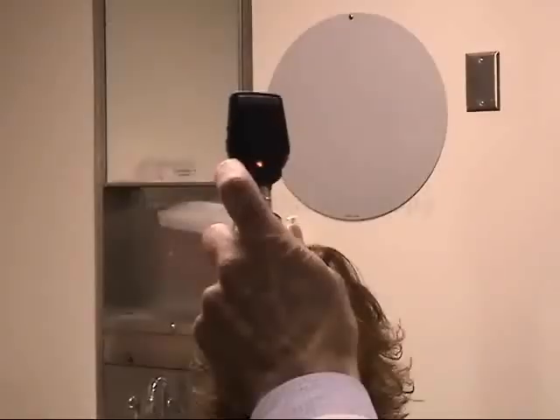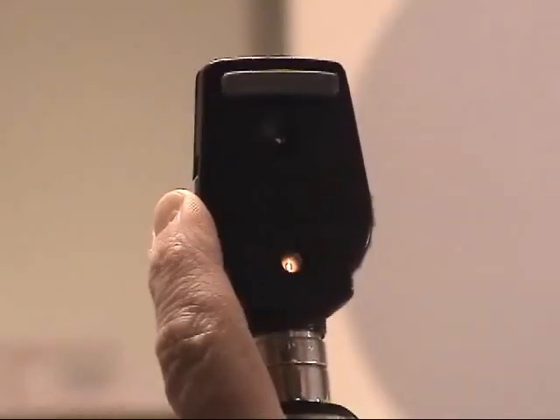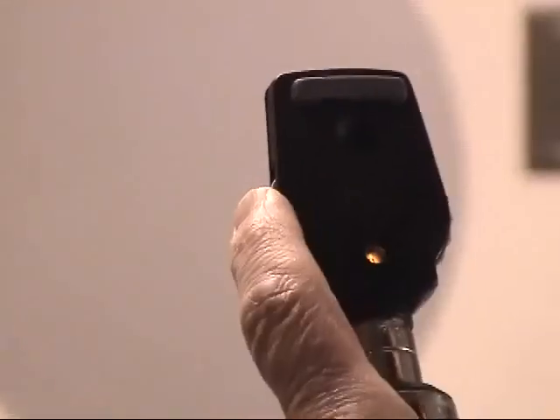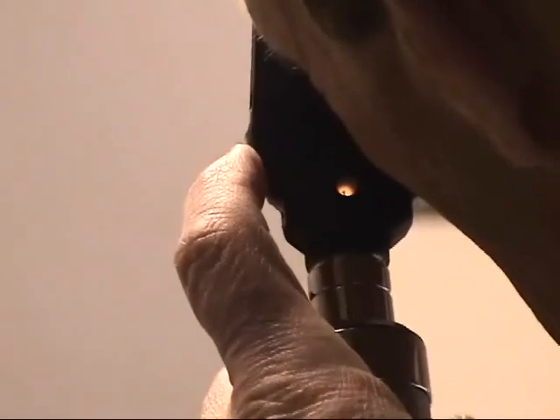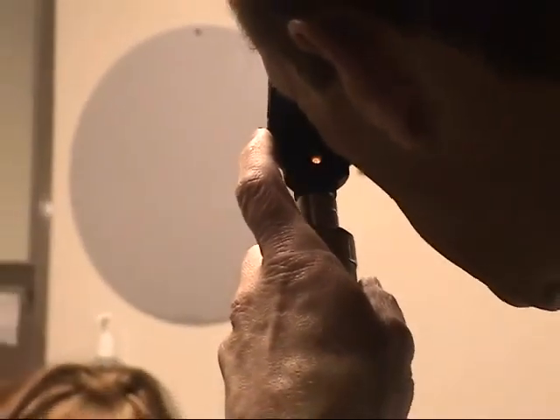Proper direct ophthalmoscopy requires good technique. Here are the steps. First, darken the room. Make sure you and the patient are comfortably seated. Place your index finger on the dioptric dial and set it to zero.